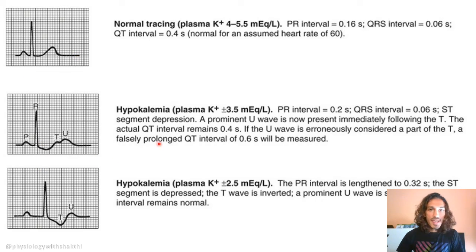Okay, so when that is happening, you see hypokalemia less than 3.5 milliequivalent. You can see the prominence of U wave, the T wave has become broader and its amplitude has decreased. Okay, and over here you can see ST segment depression as well. So all these are because of repolarization problems. Delayed repolarization is resulting in all these problems.